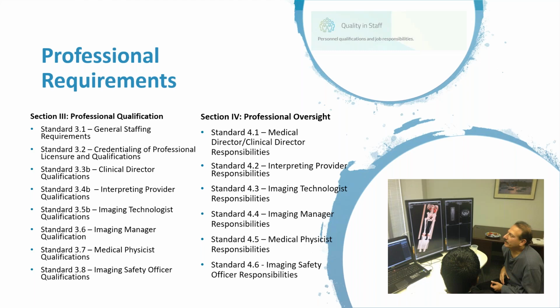And as we've written these requirements, we have, in many cases, created little sections that have additional requirements for different subspecialties. So, for instance, in standard 3.6C, we've got the training requirements. And depending on the type of person we're talking about, they're going to have different types of training. And so we've got requirements for dental maxillofacial, we've got a separate set for ENT, a separate set for orthopedics, podiatric, and mammography.